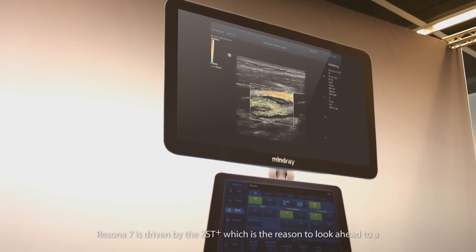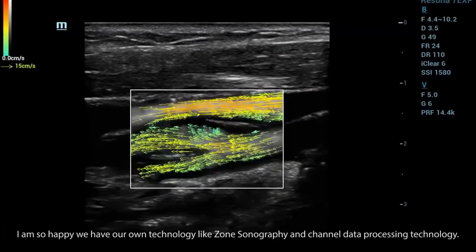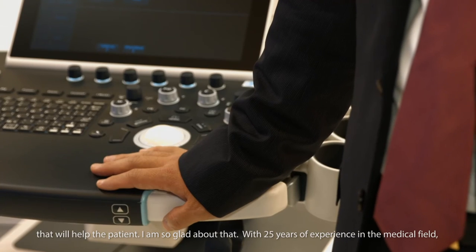Resona 7 is driven by ZST Plus, which is the reason to look ahead to a prosperous future. The first premium ultrasound system from the company leads the way towards other market segments in the next few years. Providing high quality, innovative products to help the healthcare system is our mission. Resona 7 is the first premium machine Mindray has launched into this market. With our own technologies like Zone Sonography and channel data processing, we can help doctors make faster, more accurate, and confident diagnostic decisions — and that will help the patient. With 25 years of experience in the medical field, Mindray has the expertise to develop more high-end machines.